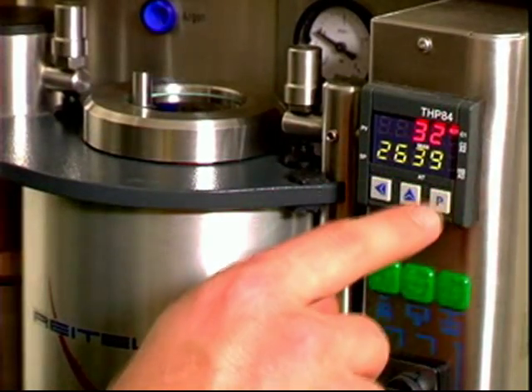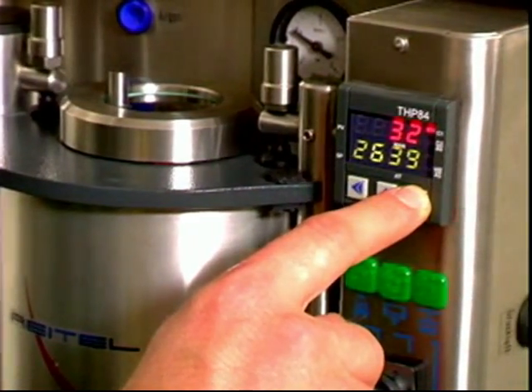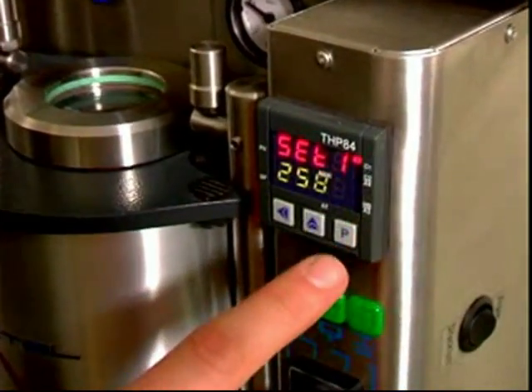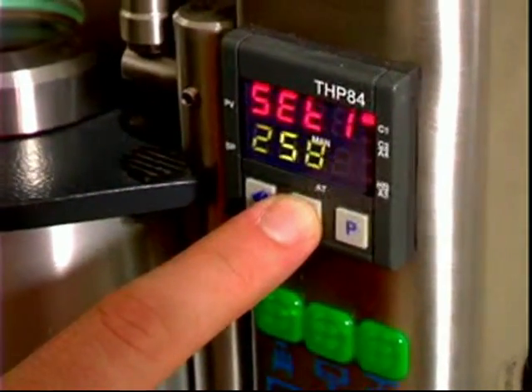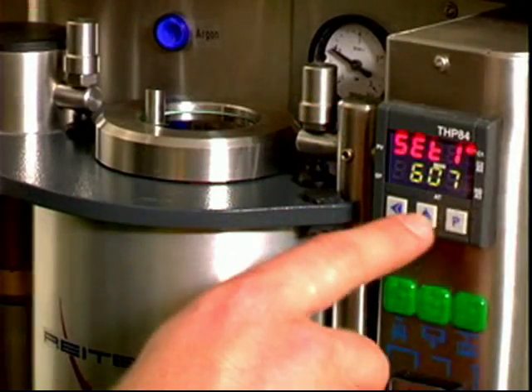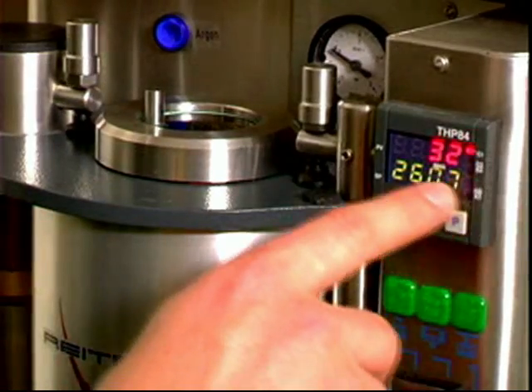Here are the instructions to program the unit. Push the P button and hold it for a couple of seconds until the word 'operate' comes on the display. Then push it one more time and the temperature is ready to be changed. With the up arrow, you bring the numbers up. With the left arrow, you push the cursor to the left. Push the P button again and the temperature is programmed.